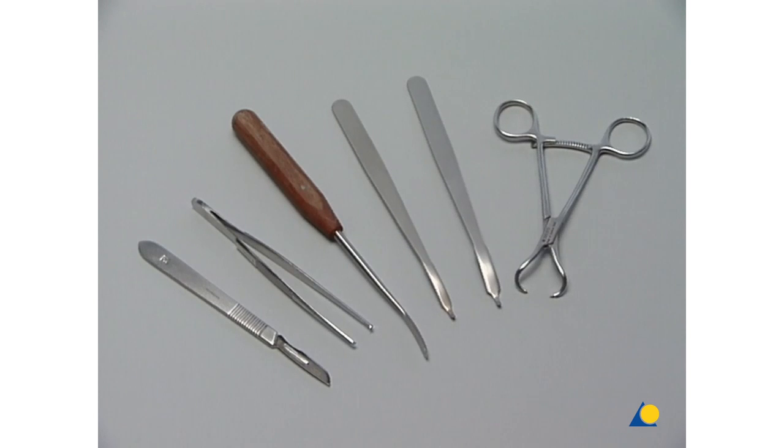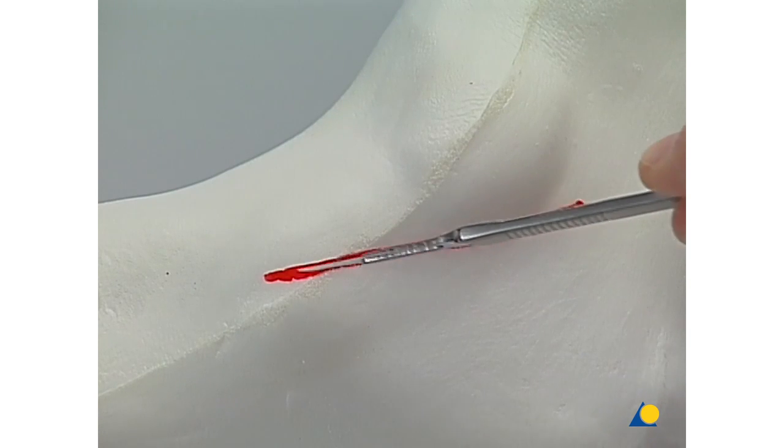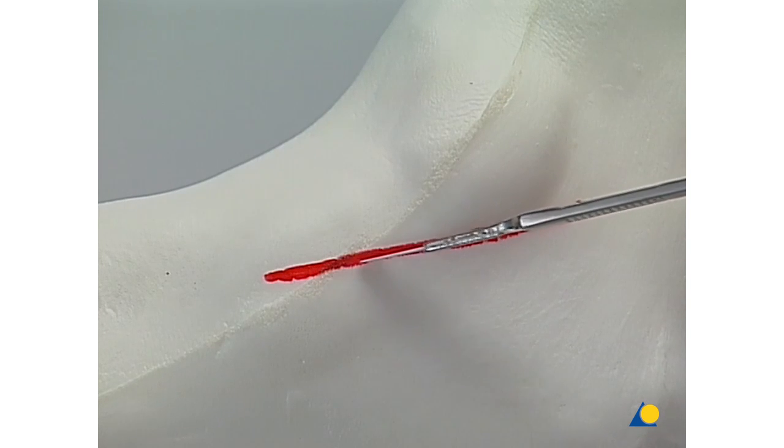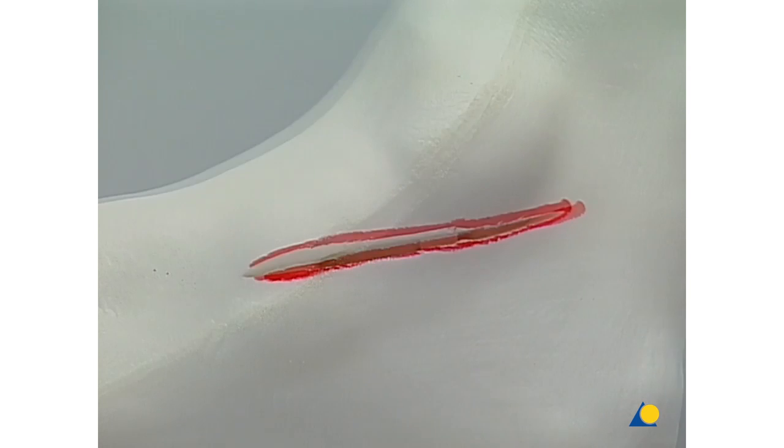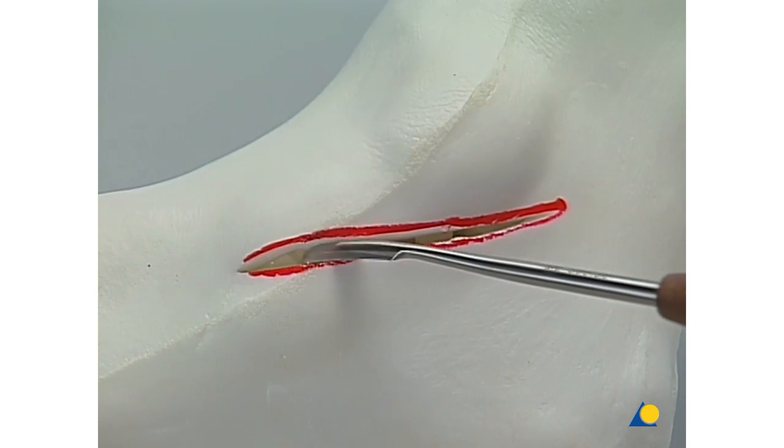For the incision and the reduction of the fragments we need this selection of instruments. The incision is made at a right angle to the skin and straight down to the bone. Soft tissue is released using the small periosteal elevator.